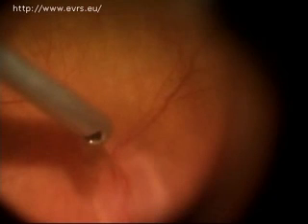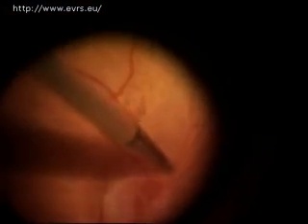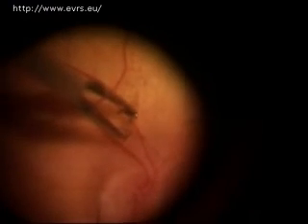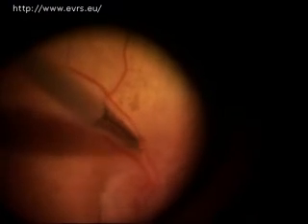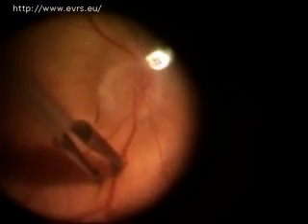In the first case, after vitrectomy, we observe attachment of the vitreous on the optic disc. We suggest that this is the entry site for the blood. A similar clinical picture was also noted in the other eye of this patient. Clinically, along the vascular arcades we observed brownish spots which may correspond to blood remnants.